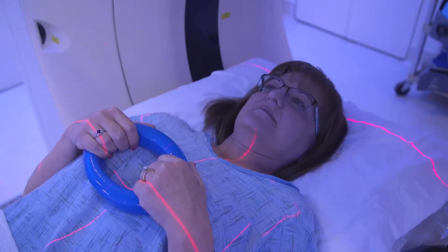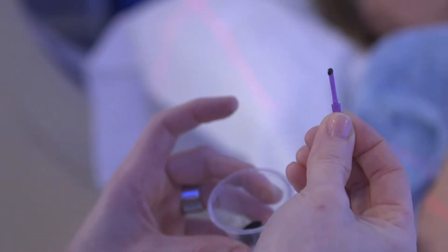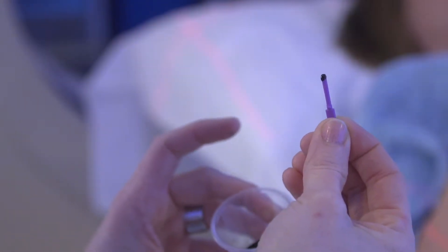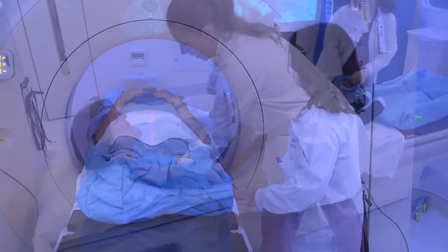After you are positioned, therapists may use a marker or very small tattoos on your body to ensure that treatment is delivered precisely every time.